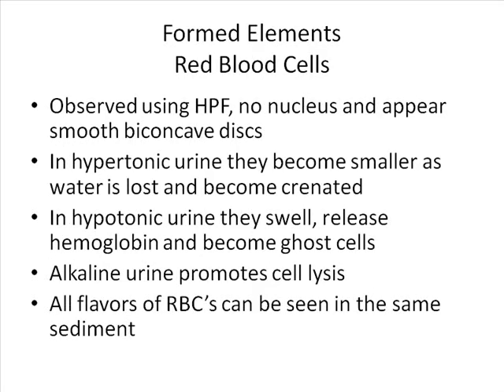All right, now what should you do? First, you want to look at those formed elements. Red cells, use high power. They are biconcave. We know that they look smooth. By your experience now, you should be able to tell a red cell from a white cell, no problem. As urine sits, especially urine that is hypotonic or low specific gravity, those cells start to swell and they'll look larger. Sometimes you'll even see ghost cells.